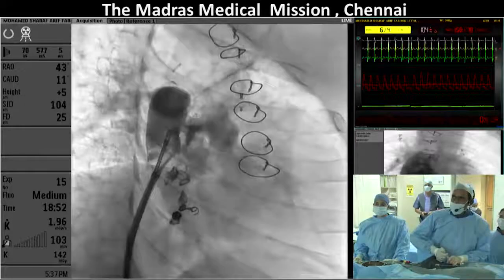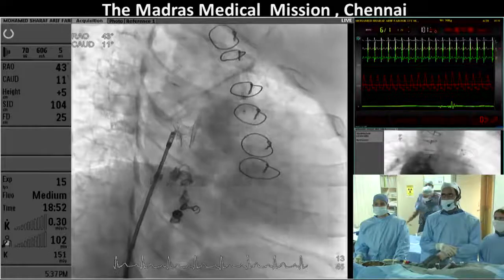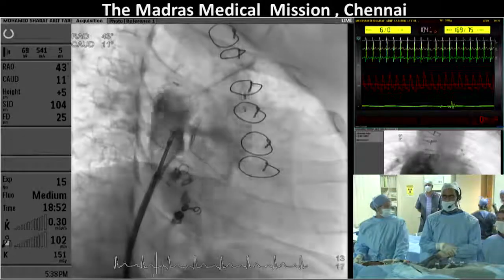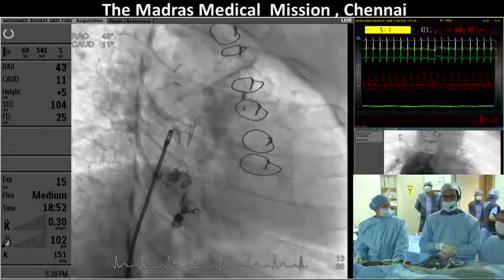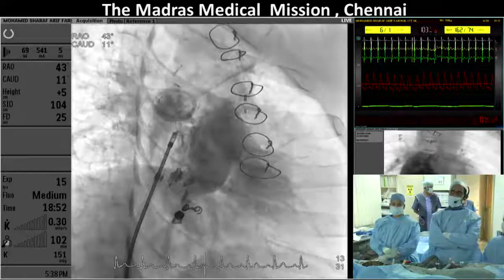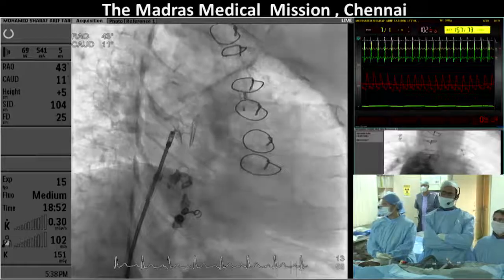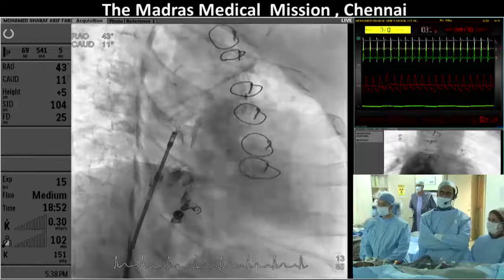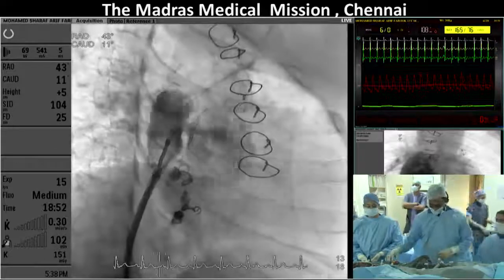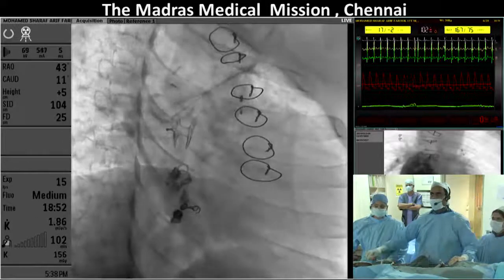We're about to go back to Frankfurt, but the only comment I would like to make is that this is a brand new procedure. It's going to be unpredictable precisely how devices like this are going to behave. They're going to behave differently in low flow versus high flow situations. And the only way for the field to know how big a device like this should be is through a trial and error process. And I don't really think there's any other way to figure out how best to do this. Allison, can we go? But thank you very much for an extremely informative and very interesting case. So, I think it is likely that this device will find a place in the management of significant congenital heart disease.